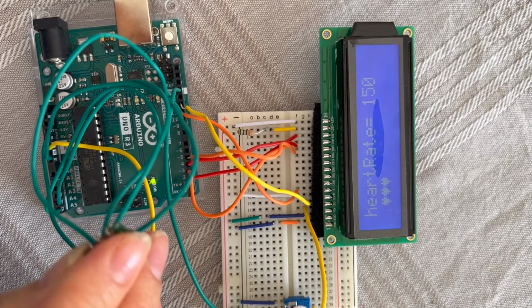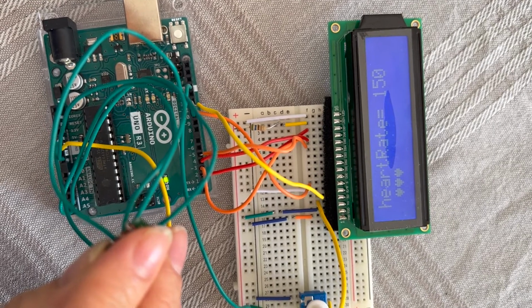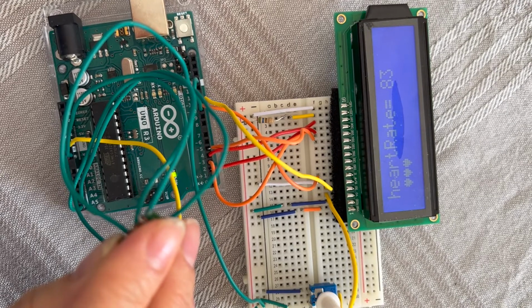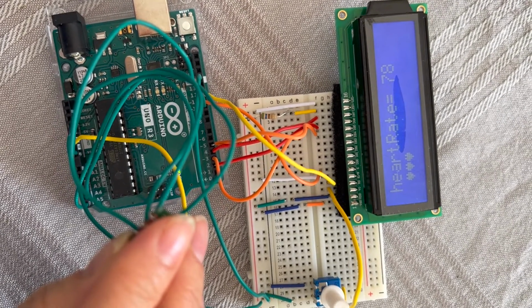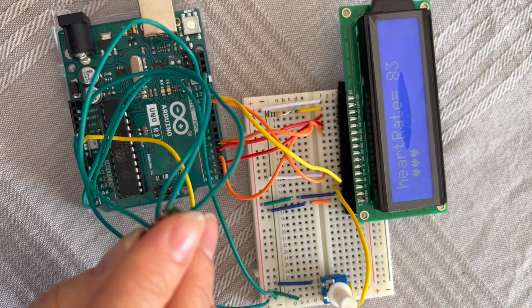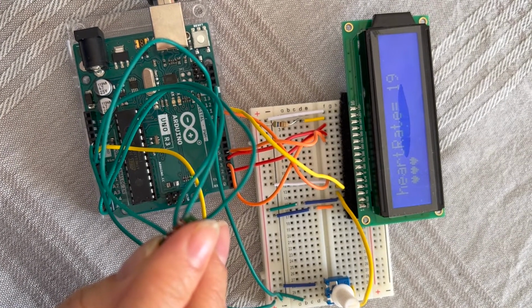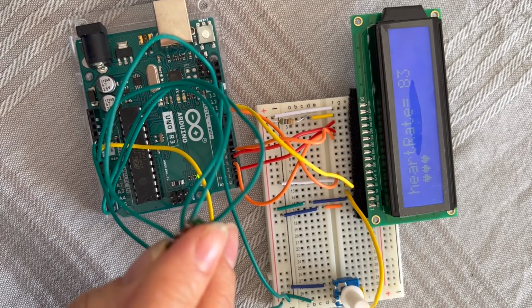Hello. We're gonna build a pulse oximeter where you place your finger on the sensor and then you see your heartbeat rate on LCD or serial monitor. So basically, in this tutorial, I'm using Arduino startup kit, which has LCD, the Arduino board, the breadboard, and potentiometer. All the wires we need, everything inside it, except the sensor that you can provide it from Amazon or any other web store. You can find it anywhere.